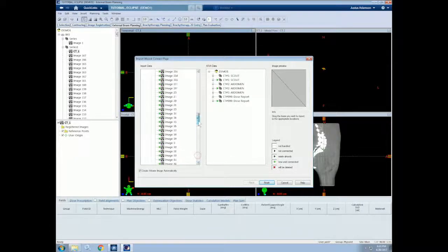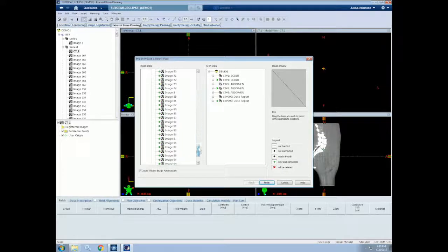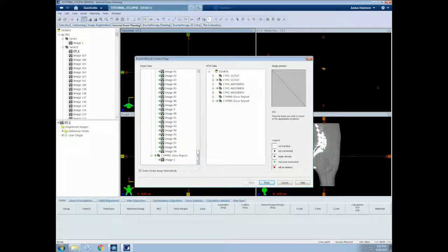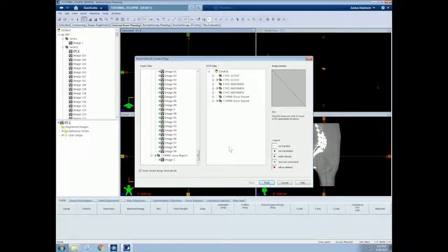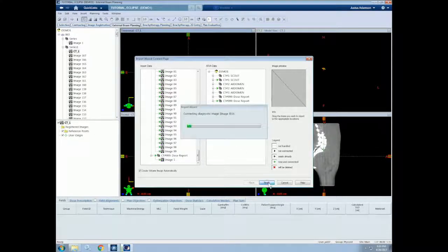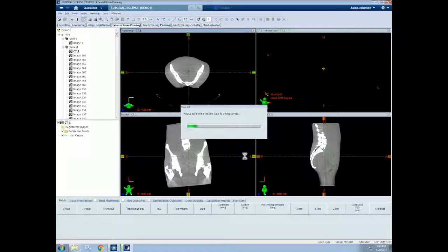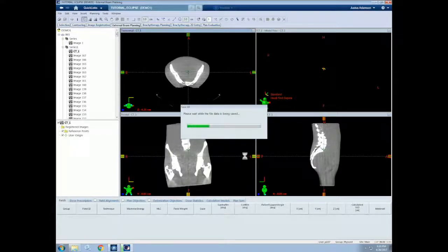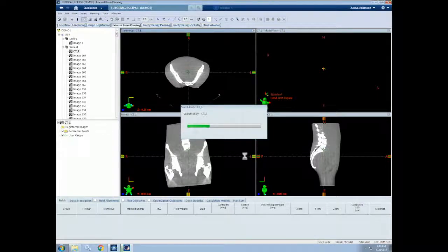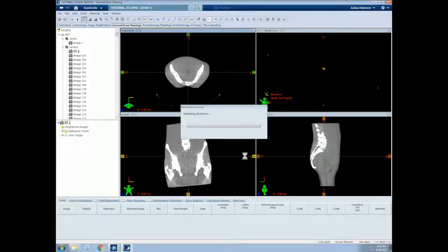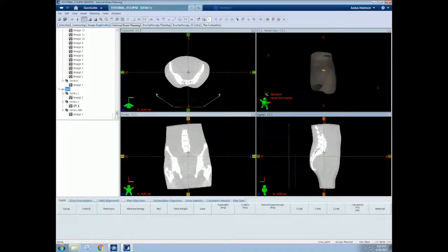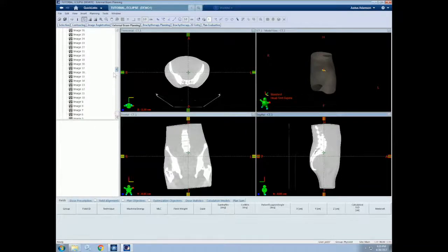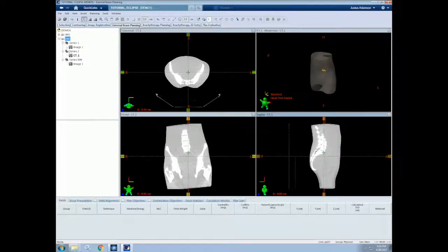Now it shows all of the CT images on the left hand side, as well as the images that we already have on the right hand side. So we can select Finish. And these images are now being imported into that patient. As you can see, now we have series 866 as well as 865, each with their own CT scan.